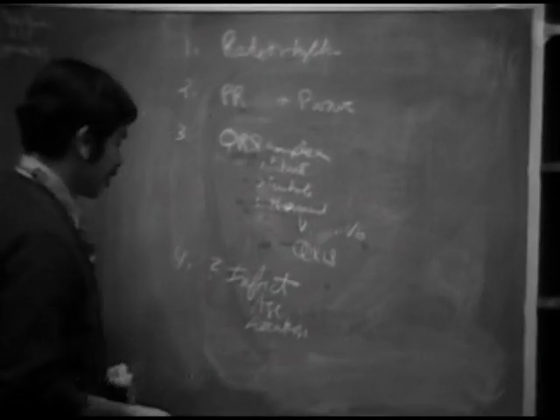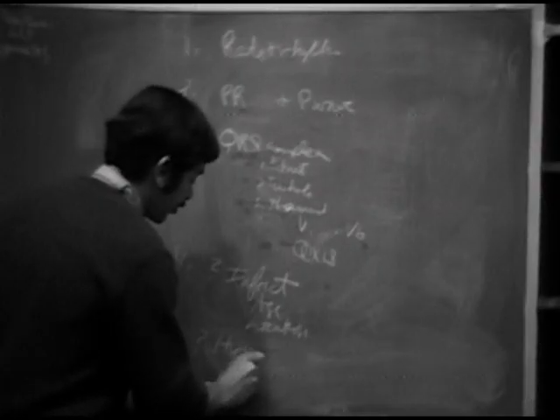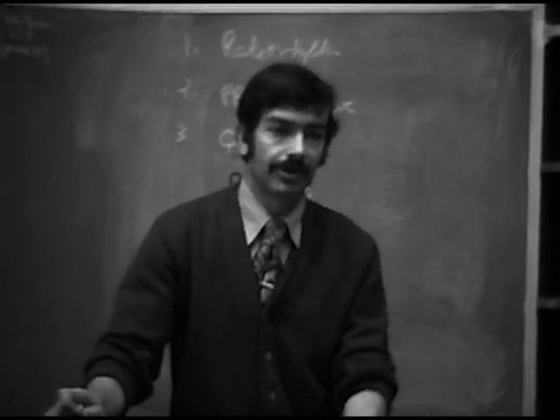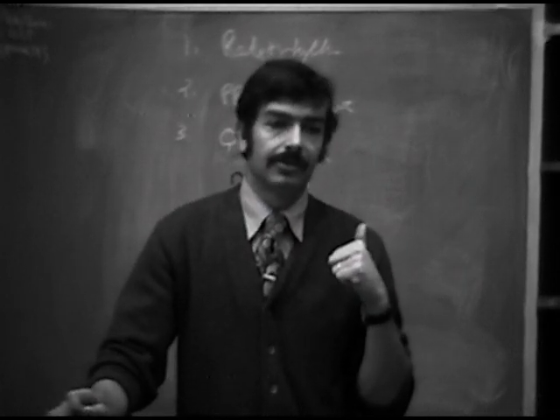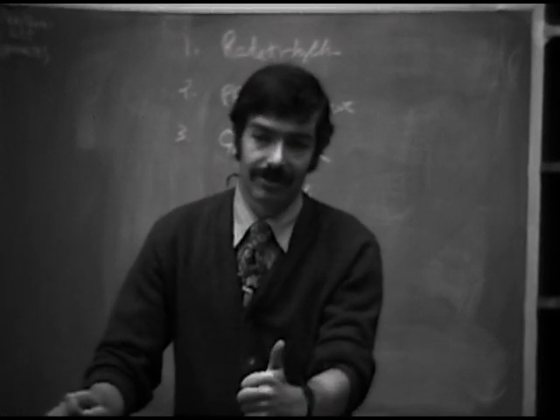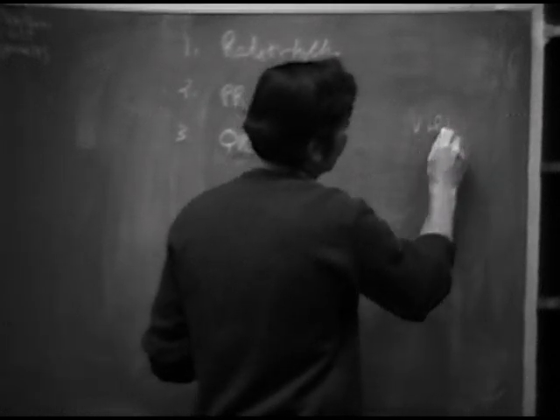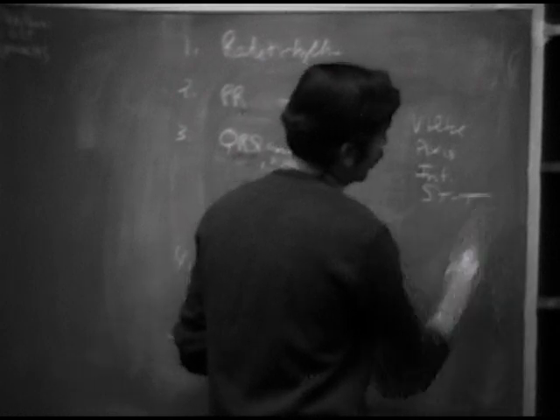Well, let's say there was no infarct, and we go on to the next step. And we ask ourselves, is there hypertrophy? And for hypertrophy, we go through our criteria we listed before. What are the criteria for hypertrophy? Those include voltage, axis, intrinsicoid, and ST wave changes. Let's put that. Voltage, axis, intrinsicoid, and ST wave changes.